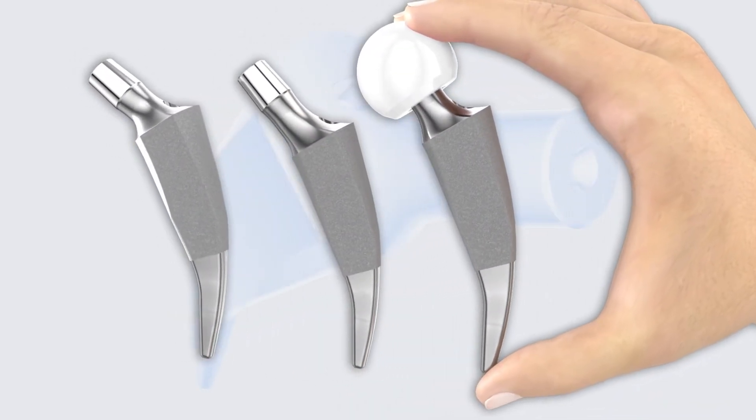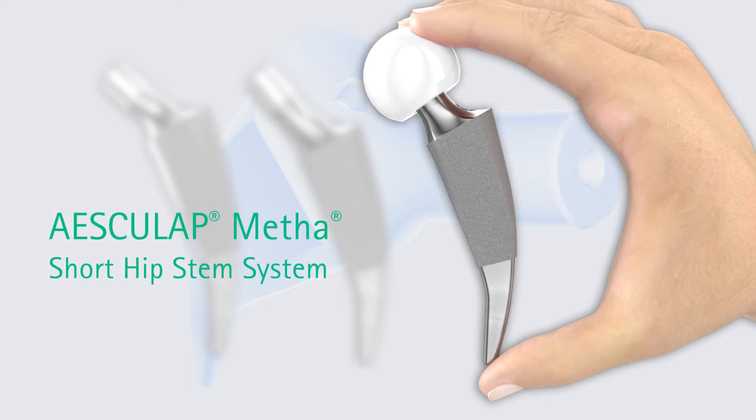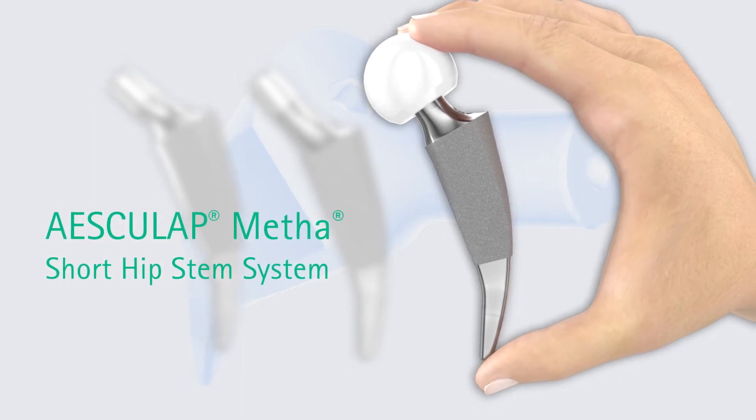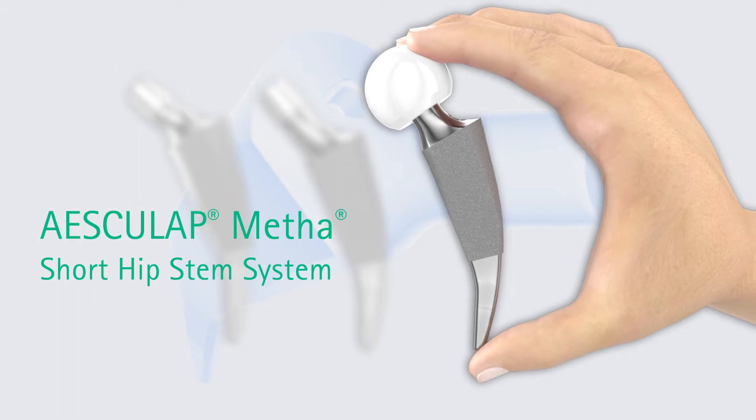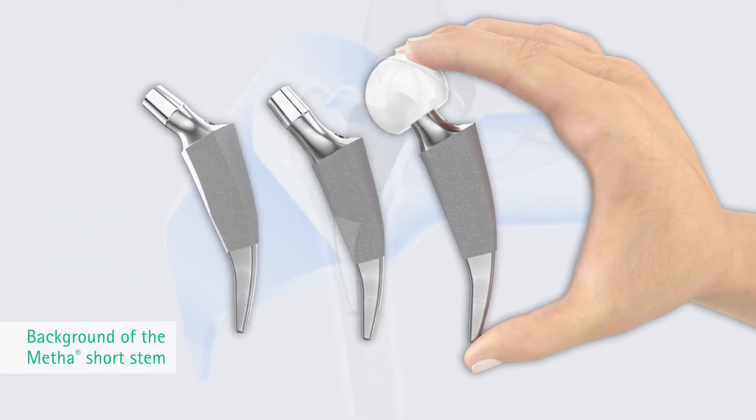The Metha prosthesis represents a short stem hip implant for cementless implantation. It combines two aspects: small stem size and a circumferential coating. As a result, it supports less invasive procedures.